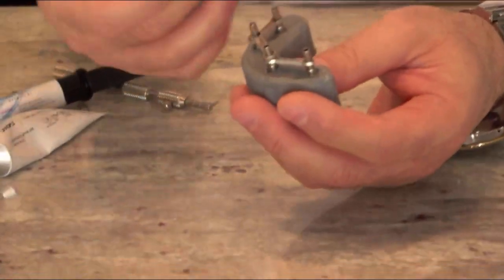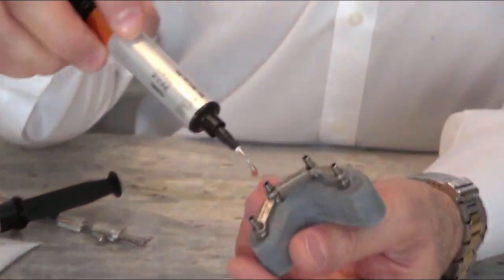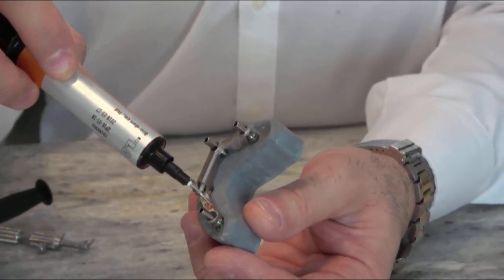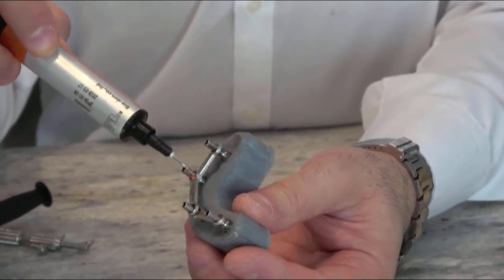Now you can continue with the light cure material. You see those gaps between the Easy Bar and the titanium cylinder? Squeeze it in, make sure everything is immersed and cure it really well so nothing is unset.